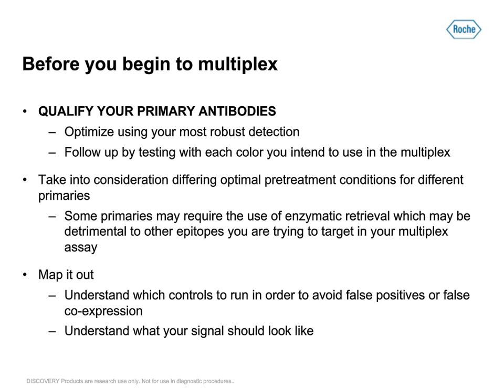And then also, it's very helpful, at least to me, to map out what I'm doing. So if you're going to be dealing with 2 mouse primary monoclonals and 1 rabbit monoclonal, just map it out so that you can see, okay, I'm going to detect this mouse primary with this mouse detection, and I'm going to detect this rabbit with this rabbit detection. That way, when you map it out, you can actually see where there is potential for false colocalization, false cross-reactivity, anything like that.